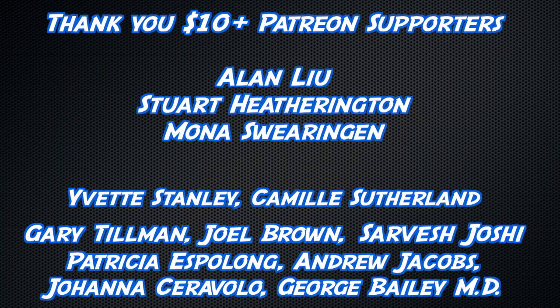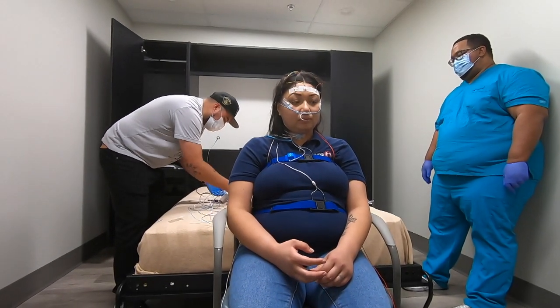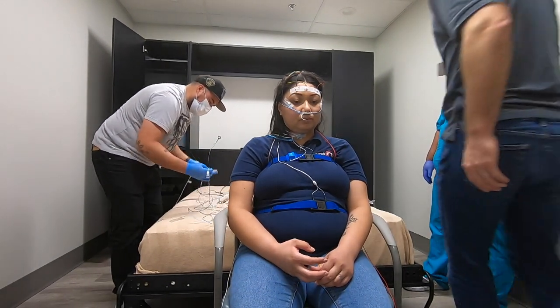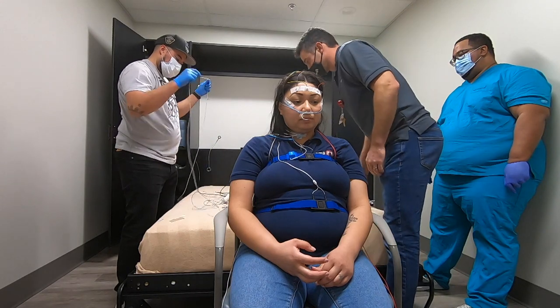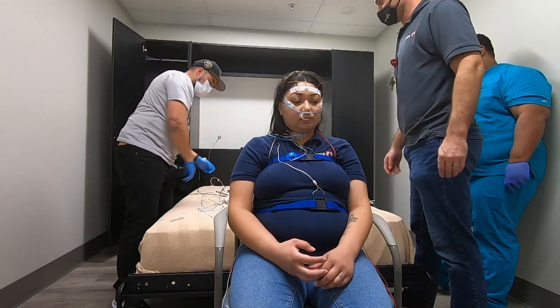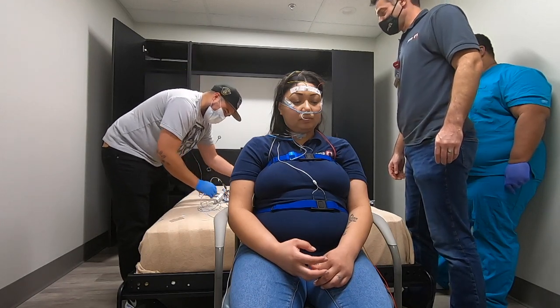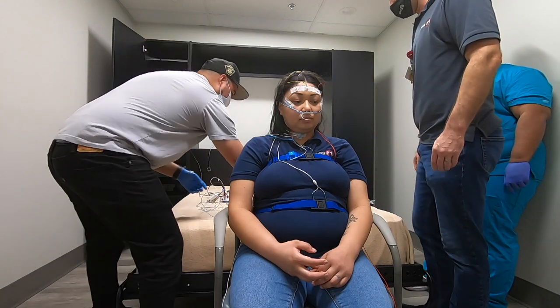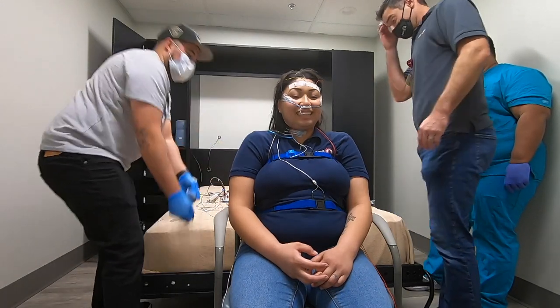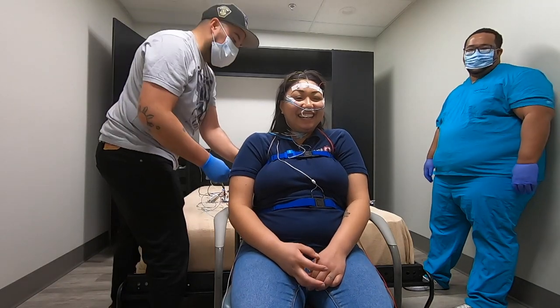You know how you take the connector pin into the head box? You don't just yank it. You push down — it's like a slide. Sometimes you have to put your foot on it to keep it stable and use your lower back. Don't use your knees. Thank you.